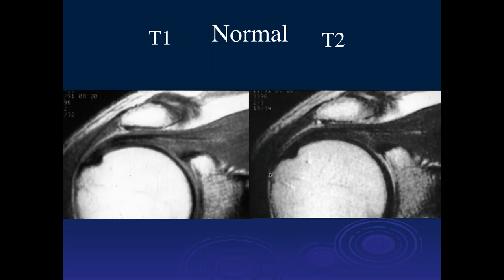We used to do T1 and T2 weighted images, but now we primarily do T2 and PD fat-sat images. Typically, the normal tendon should be black on both sequences. The musculotendinous junction should be right around the 12 o'clock position.